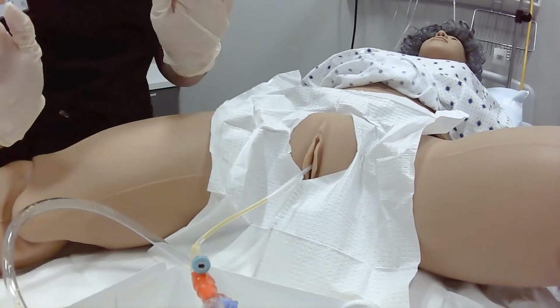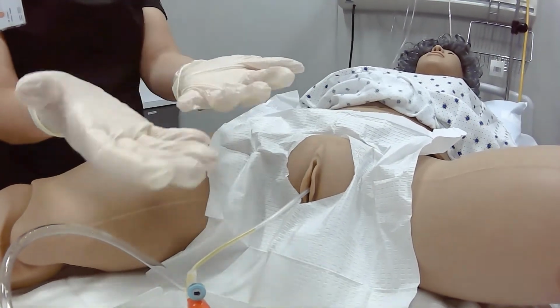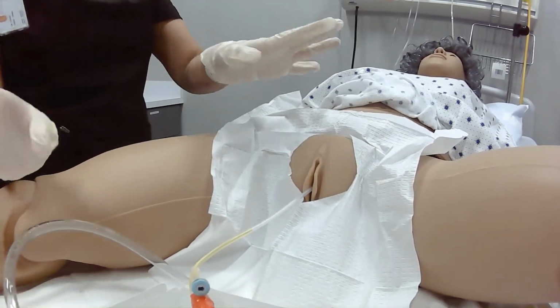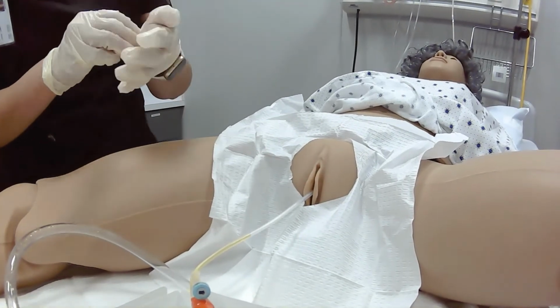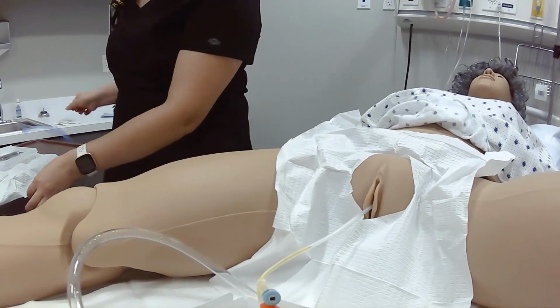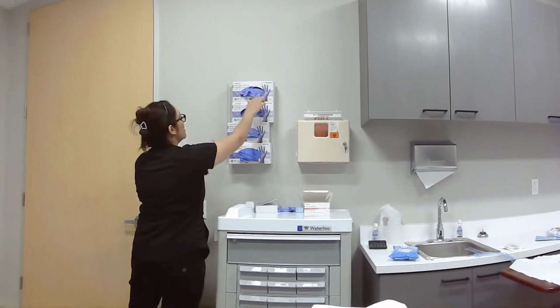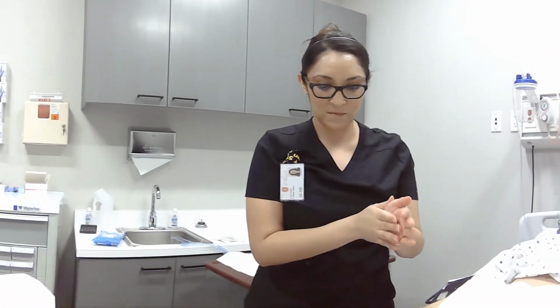And for this next piece, I'm going to change into non-sterile gloves, because these gloves are full of iodine, betadine, lubricants. We were touching the patient's genitalia, so we'll change into clean gloves and do hand hygiene. So we're going to do that. So hand hygiene and gloves. Again, making sure that we're keeping our eye on our patient so she doesn't fall for safety purposes.